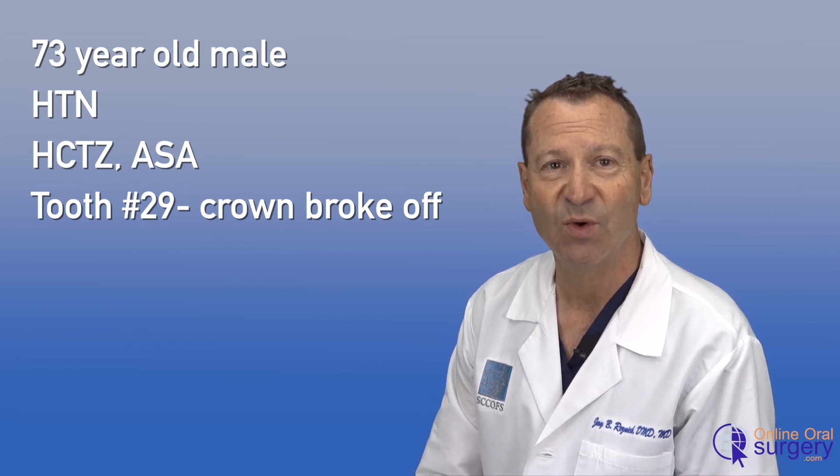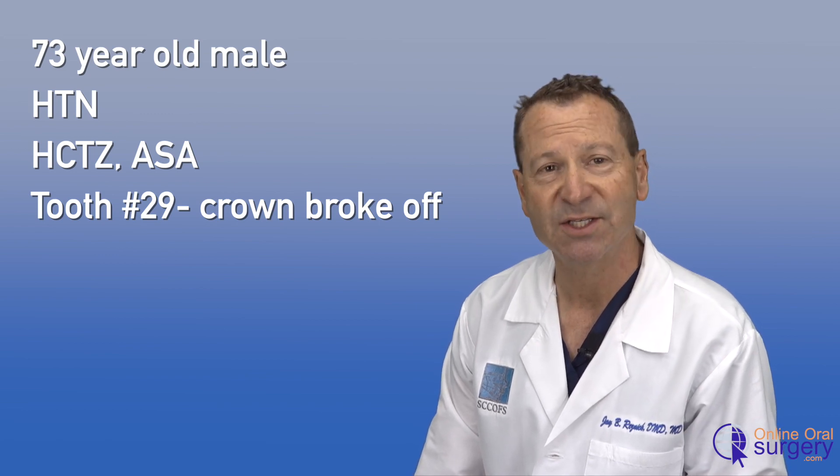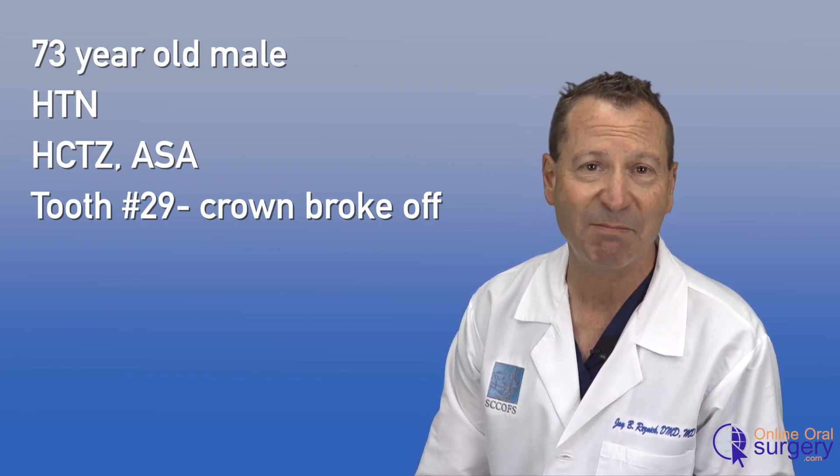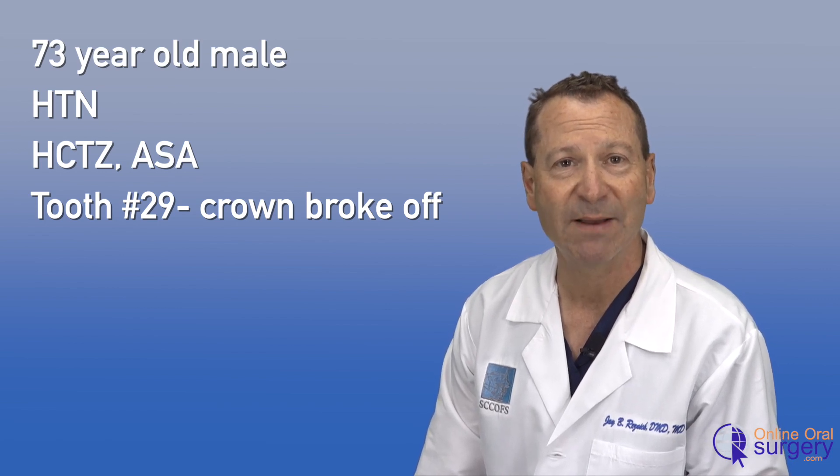You'll see in a second why he was referred. This patient is basically healthy, but he's on some hydrochlorothiazide for some mild hypertension. He's also taking aspirin, 81 milligrams per day.